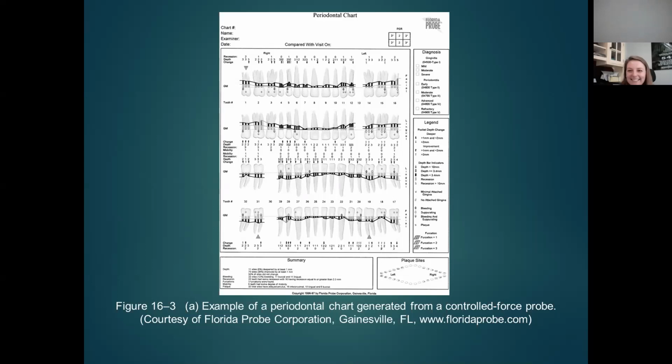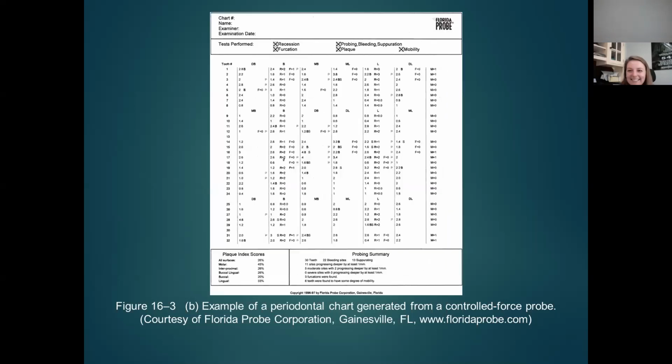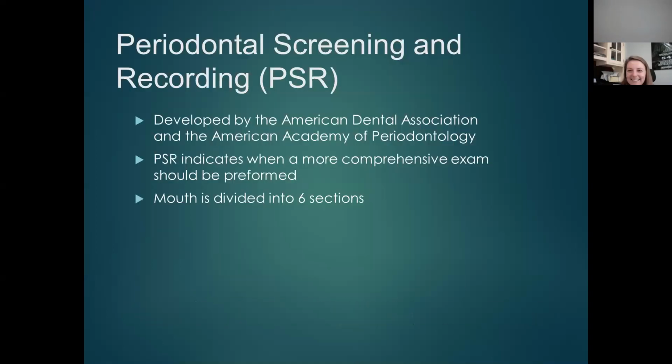And there'd be a little table up on the top of the perio chart so that when we did this time and time again with patients, we could compare the amount of healing or infection that's taken place. Because if the patient went from 32 4 and 5mm sites down to 13, we could then compliment the patient, saying, look how many millimeters of resolution that you've had. So it's just a nice broad thing. Another periodontal charting here is more in a table form. This means nothing to me, but it does have the recession and the furcation, mobility, that type of thing to get you more information.